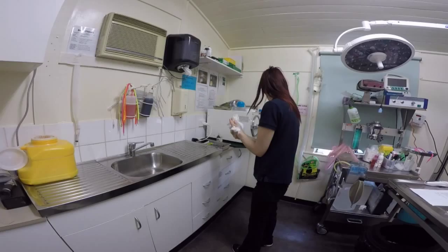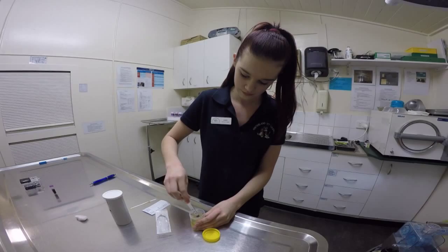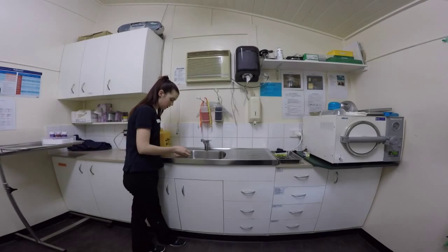Now for the urinalysis I will draw up 1ml of urine with my 3ml syringe. I will take the dipstick over to the sink and drip the urine over each square, then wait 60 seconds for the test to be accurate.